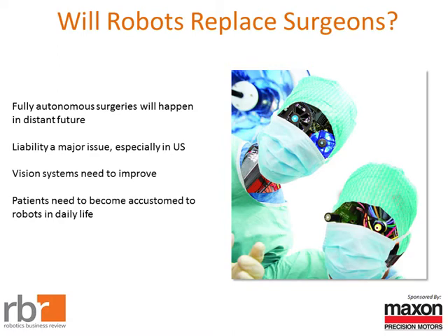The military wanted to be able to have these robots operate remotely. So you can imagine a soldier on the front lines, in a firefight, in a location that's too dangerous. The number one thing if there's a combat wound is you need to treat that soldier as quickly as possible. So there was talk of having mobile surgical platforms out on a battlefield, operated remotely by a doctor who was nowhere nearby. That was originally one of the ideas people had been talking about with these surgical robots.